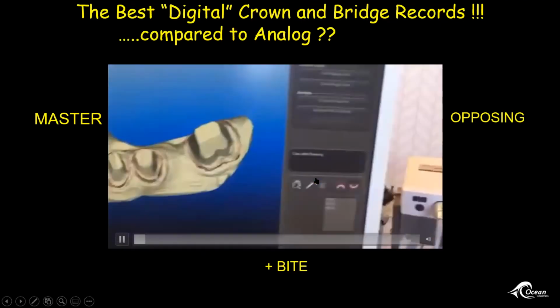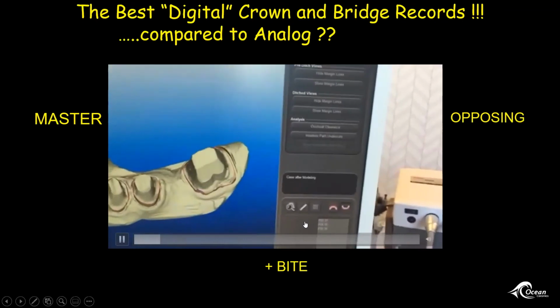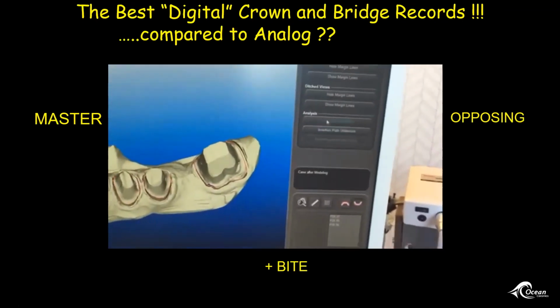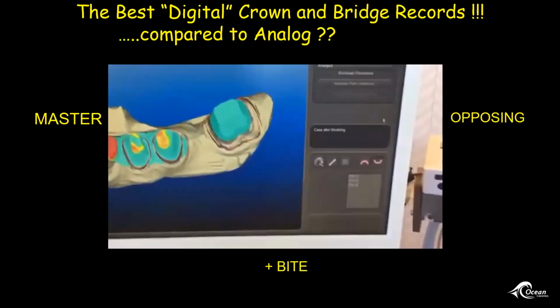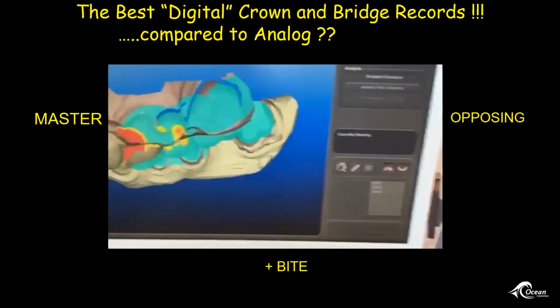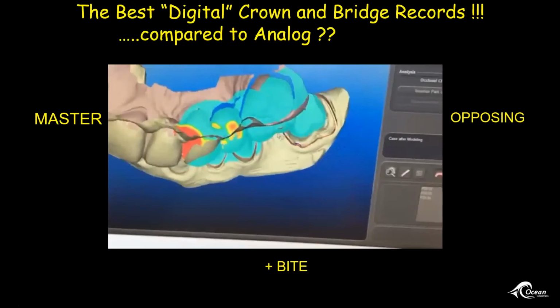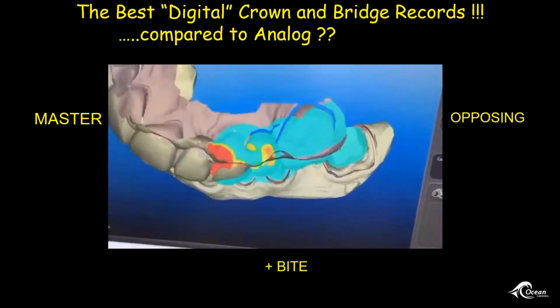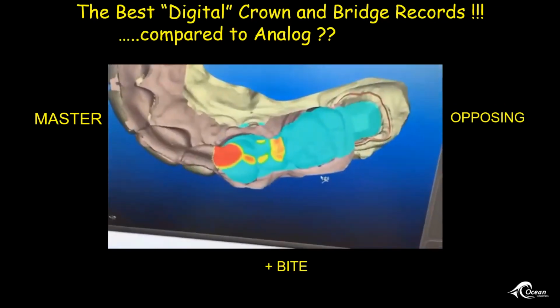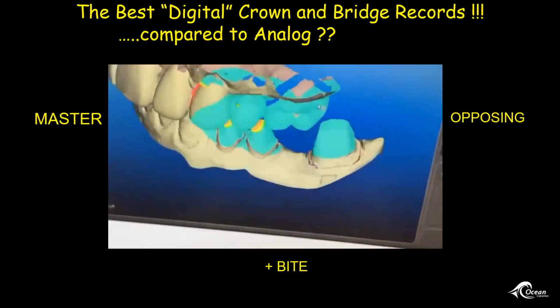So I just want to show you, there's a couple of things that come up as questions. Let's do an analysis of this. Have I taken enough tooth structure away? And so I get a bite registration or reduction measurement in 0.1 to 0.2 millimeters.